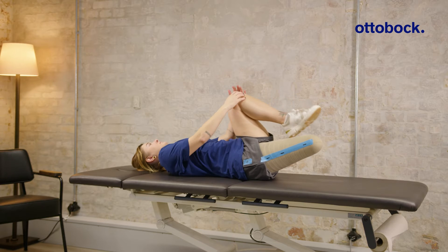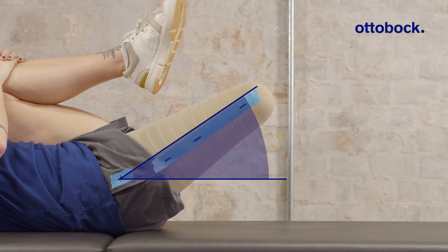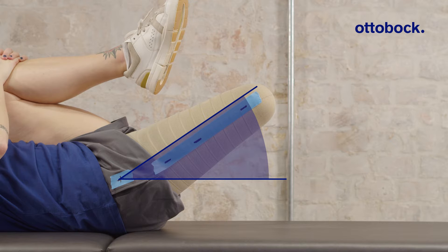One of the most common errors in prosthetic alignment results from insufficient consideration of the hip flexion contracture. This can cause hyperlordosis, back pain, and impairs prosthetic performance.